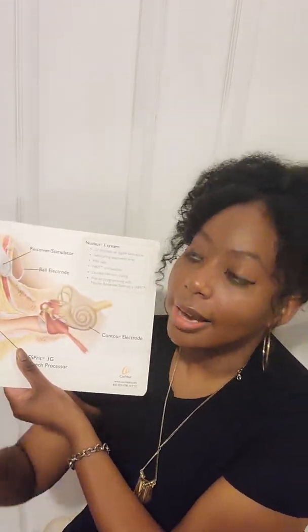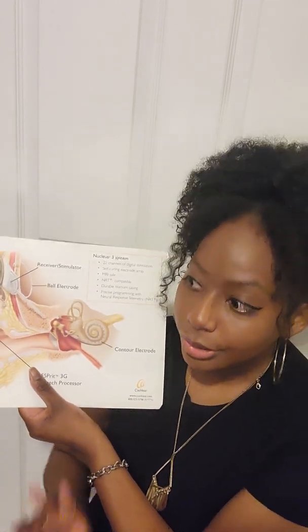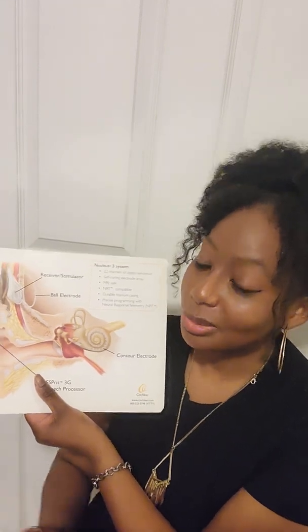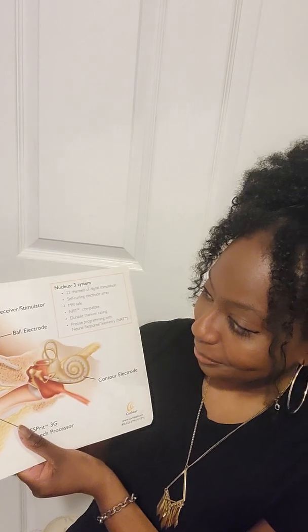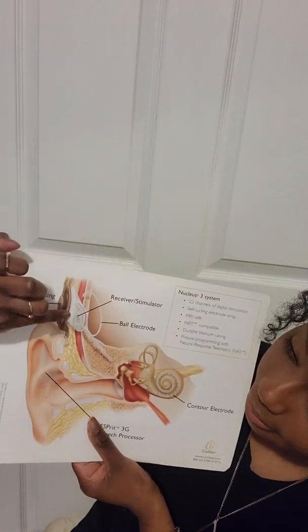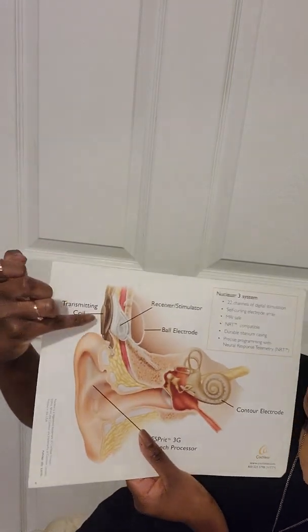So there's the two parts, the internal and then the external. The external is the implant itself, and then the internal, wait, I'm sorry. The external is the processor and the magnet. That's the outside piece. The internal is the implant itself. Those two parts. So this is the magnet, and that's the implant right here.